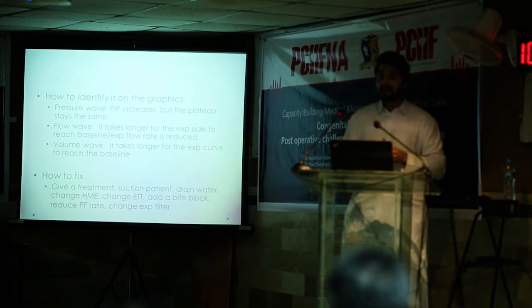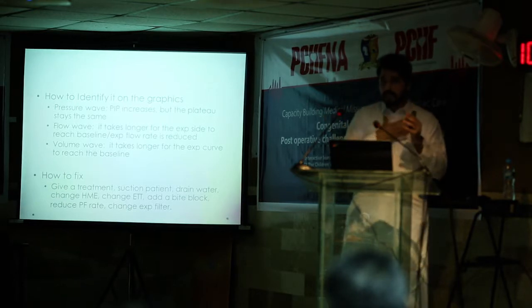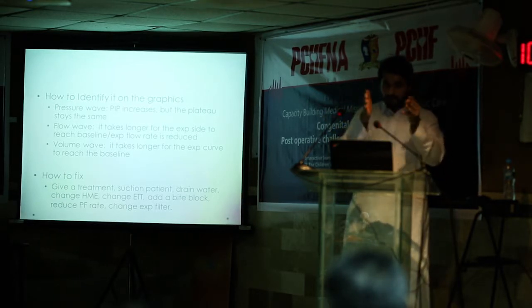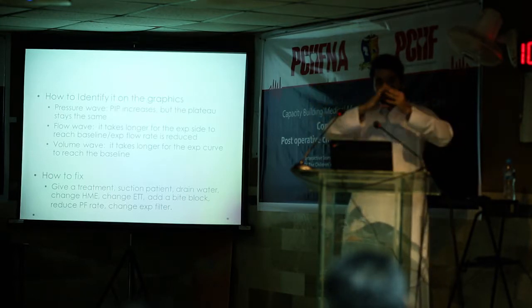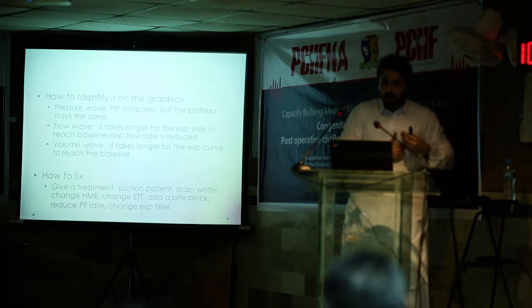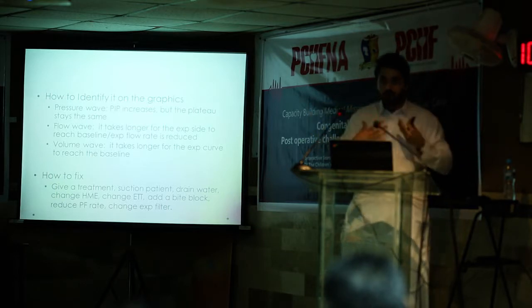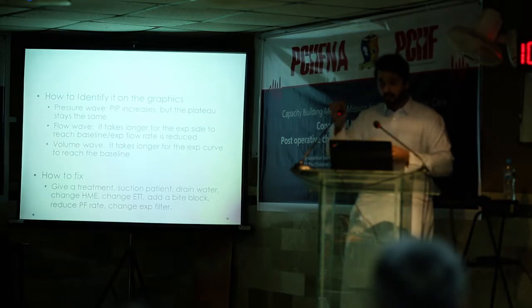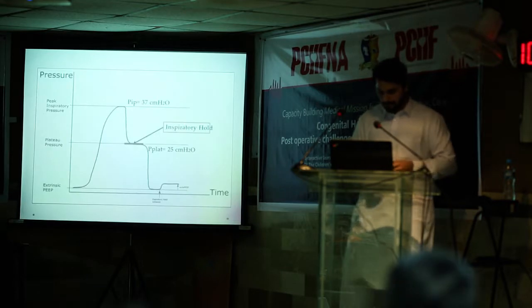Also, there is the IE ratio, the inspiratory and expiratory time. If some patient has high airway resistance, we can prolong expiration because they have resistance in the airway, so they need more exhale time to take out the volume in the lungs. So that's something we can control in the ventilator, the IE ratio, inspiratory to expiratory time.